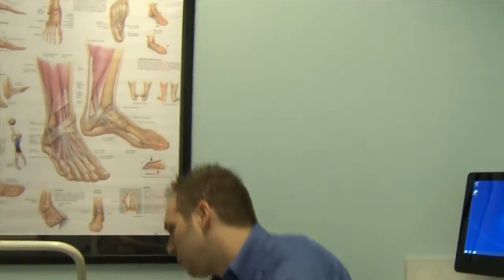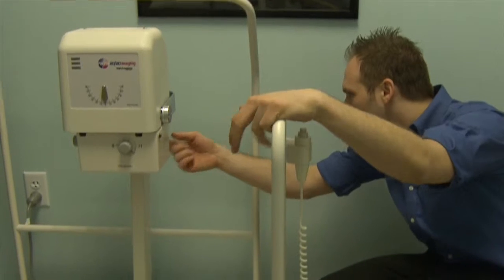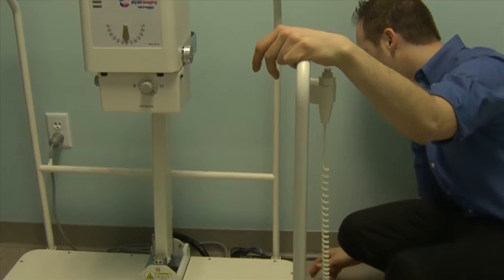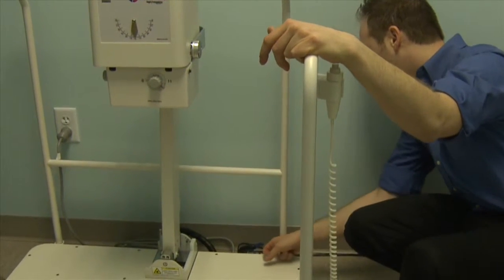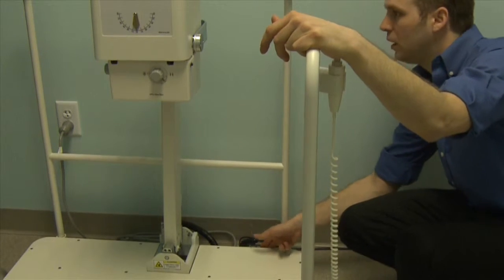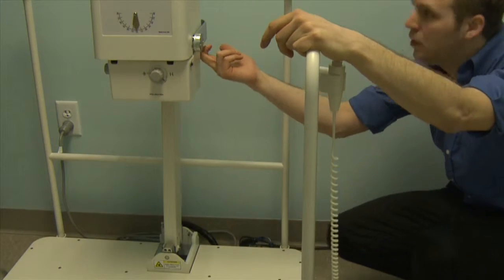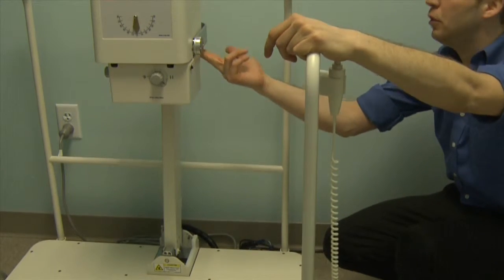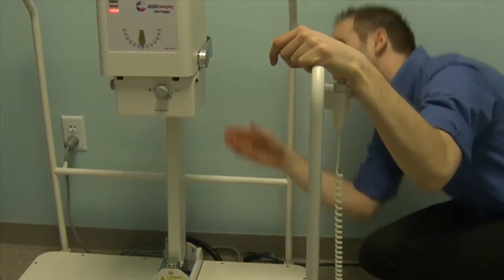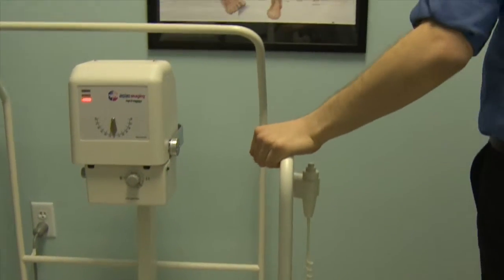To start, you'll turn on the x-ray system. There are two toggle switches — one in the very back on the bottom of the base, and one on the bottom of the two-head gear. Hit both of those on, then go ahead and turn on your computer.